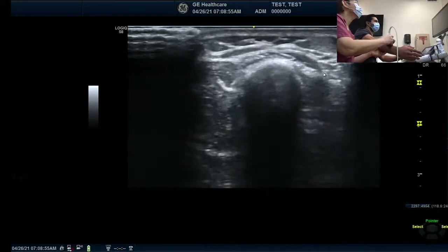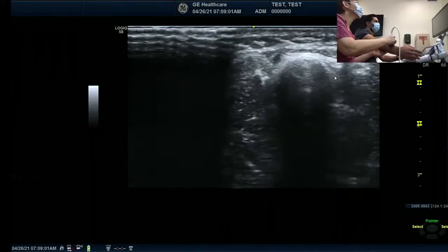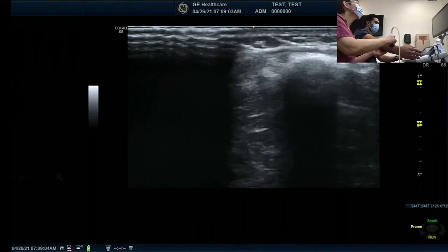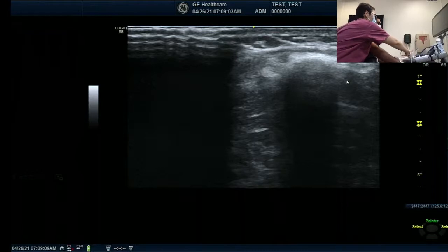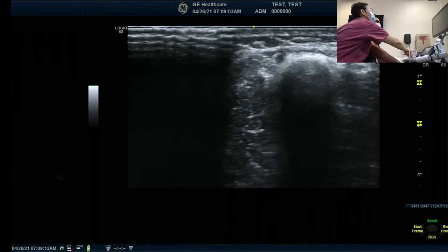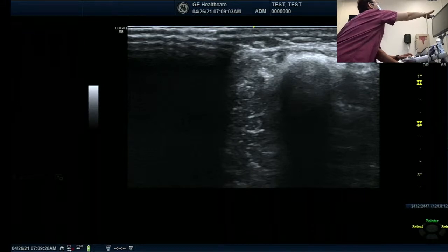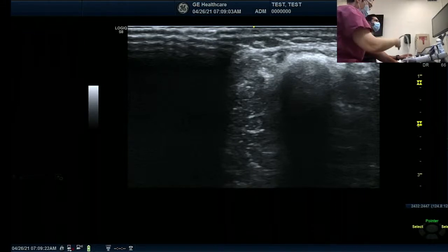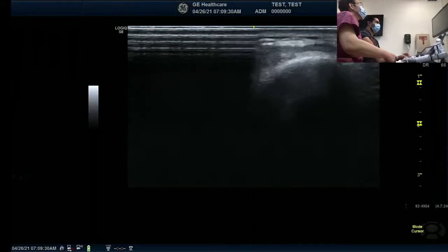Toggling. Then it's going to be hard. It's very small, right? So maybe we freeze it here. And then don't touch, oh yeah, move, since we hit this one. Then now you can confirm. Can you hit over there? A little top, yeah, the dark one. Yeah, it's going to come out, and then as they said, at the wrist, where the wrist is.